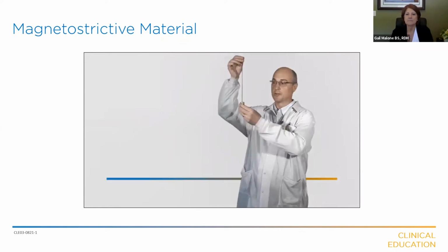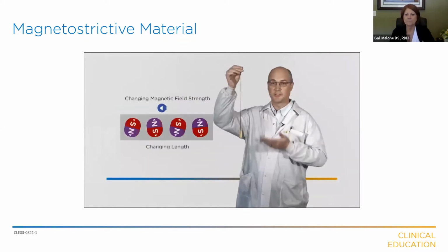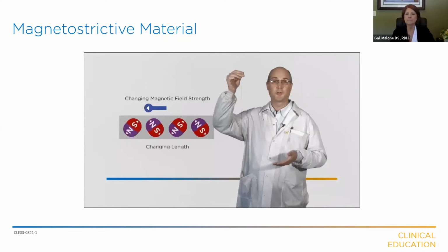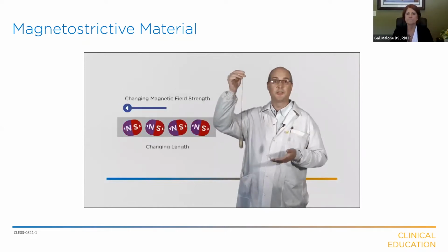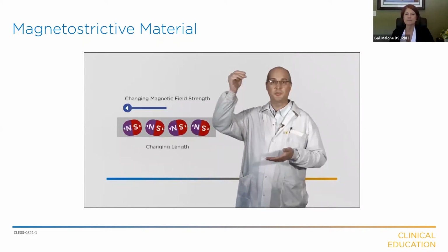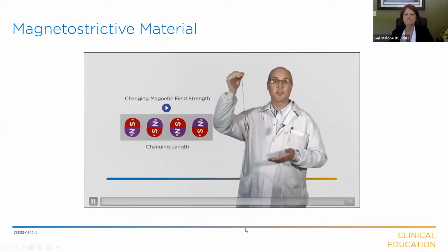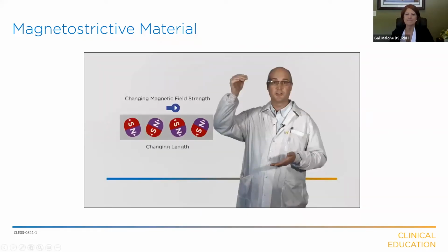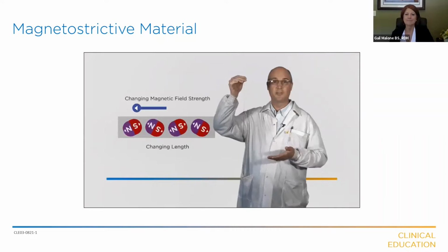Today we're going to talk a lot about vibrations, and an important concept to understand is what's called a longitudinal wave. And I brought this demonstration. This spring is experiencing a longitudinal wave. It's very much like what happens to the permanickel stack in the handpiece. A magnetic field excites the permanickel and imparts a longitudinal wave at ultrasonic speeds, and that vibration in the stack is extended out to the tip.